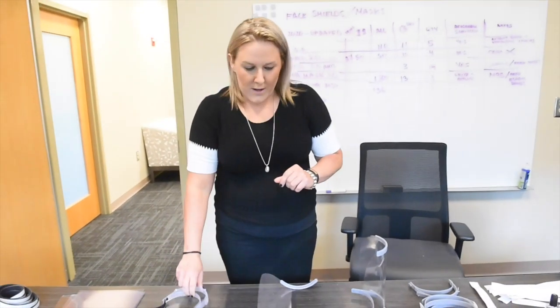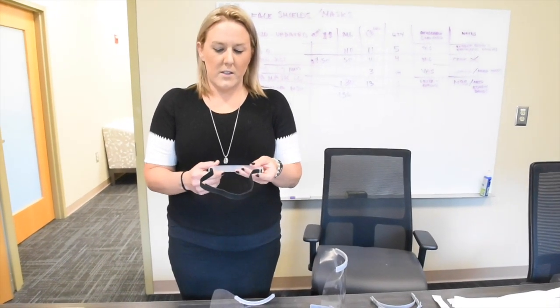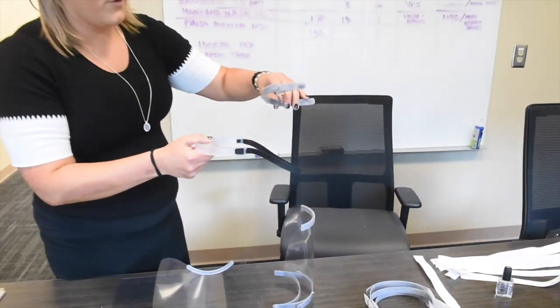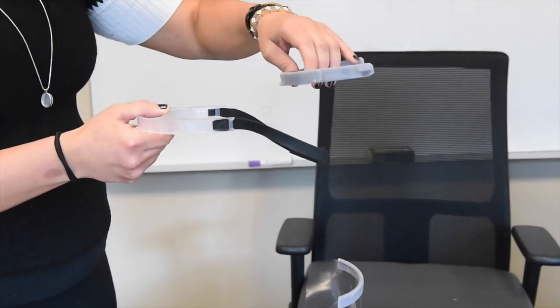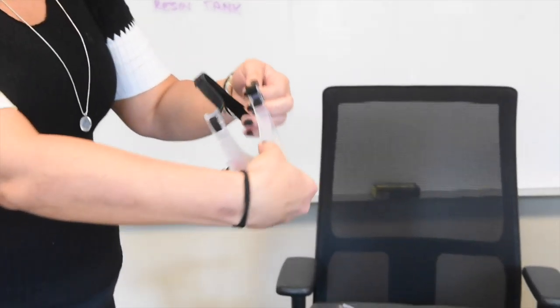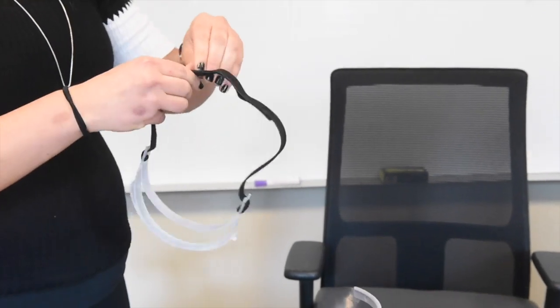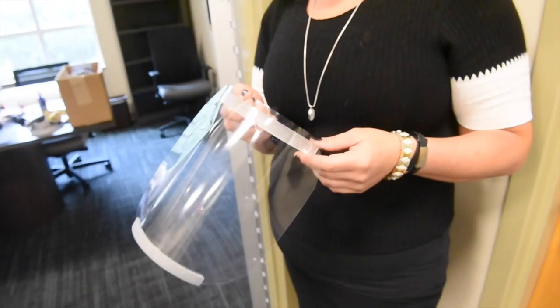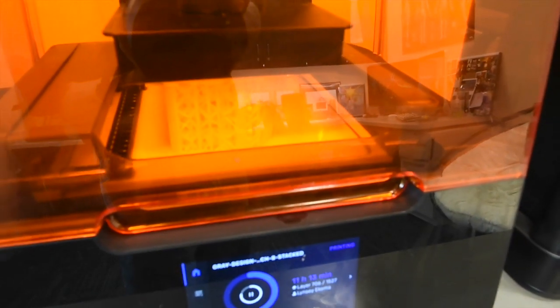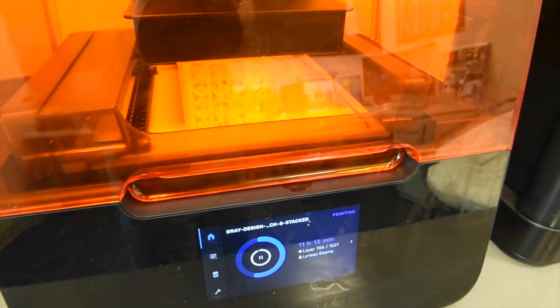We also have an Augusta University version. This is Bill Gray's design, something that he developed. Instead of notches on the end for elastic or rubber bands — which our first prototype had — he came up with a version using cut-out holes with a cinch strap design. We are able to use Velcro, string, or elastic for this adjustable band. We are now having all of our 3D printers in this collaborative effort — roughly 10 to 14 printers — working on this design.